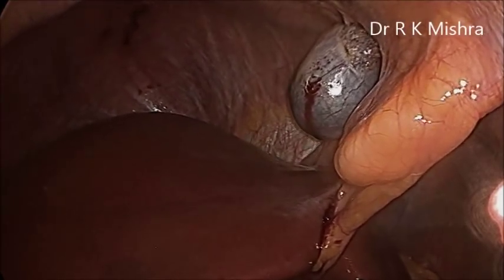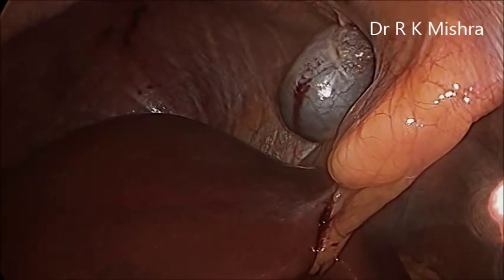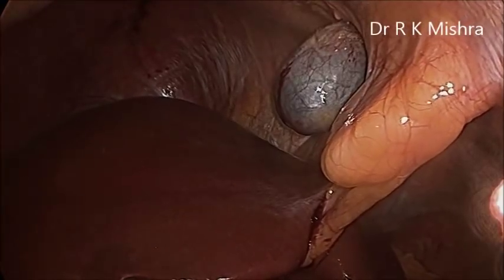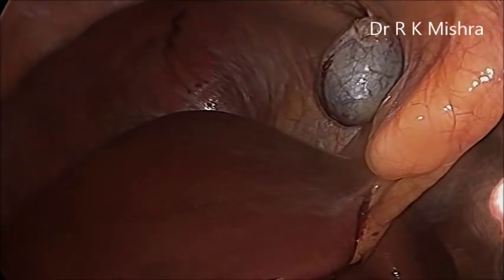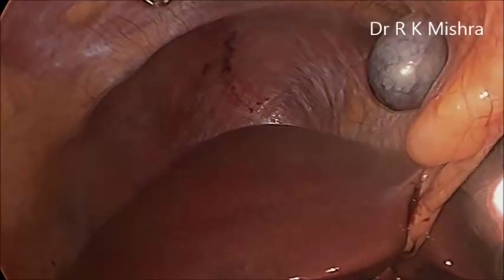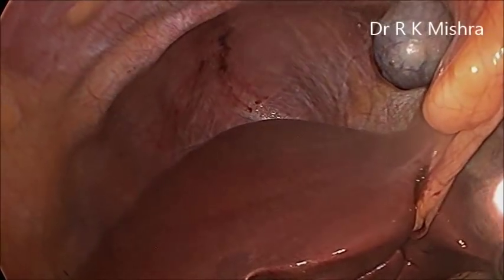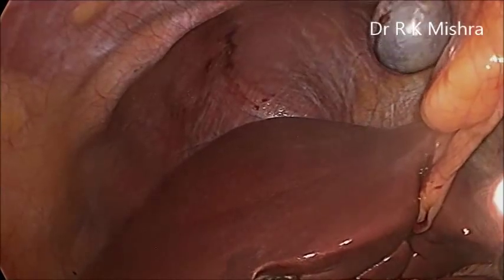Although many people dilate the skin incision there, generally I don't like to dilate it because the patient has paid for minimal access surgery, so we should spend some time to evacuate it with the ovum forceps. You can give a small nick at the neck of the gallbladder. This is the ovum forceps, and one by one you can take all the big stones out. Once the maximum number of stones come out, then slowly it will collapse, and then it will be easy.